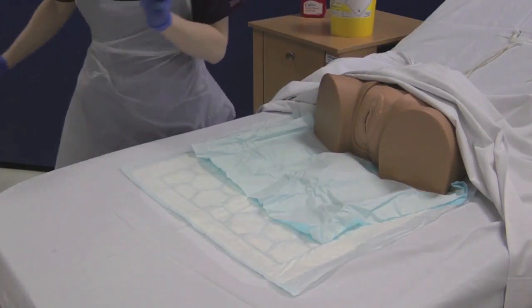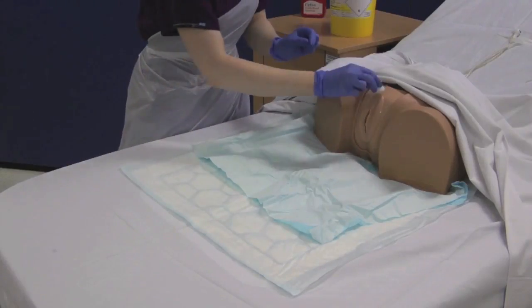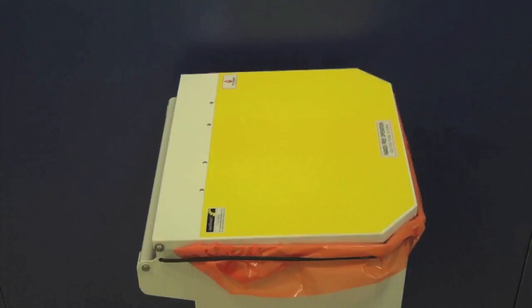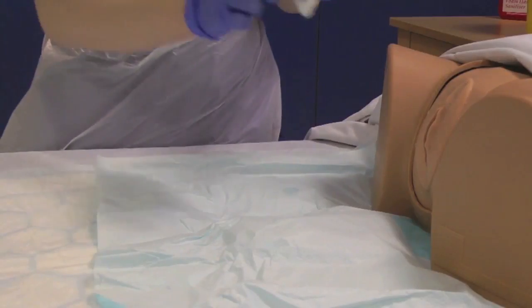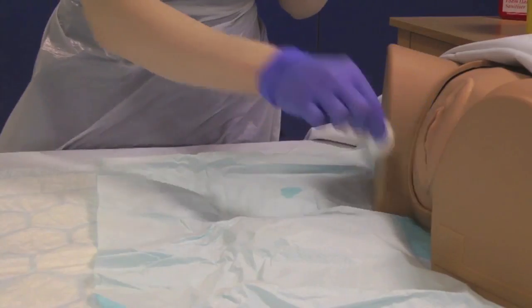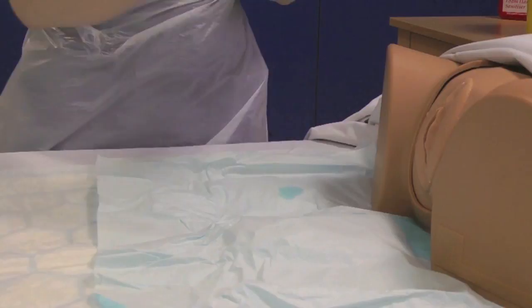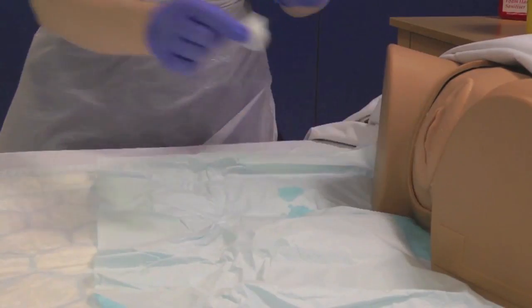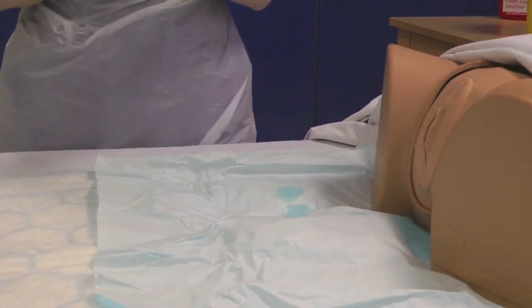UHL policy utilises a clean hand dirty hand technique as demonstrated here. Use your clean hand to pick up the sterile cotton wool balls and pass them to your dirty hand. This ensures that your sterile field is not contaminated. The dirty hand is the only hand that touches the genitalia. Use a minimum of 5 cotton wool balls cleaning from front to back, symmetrically from outside to in.